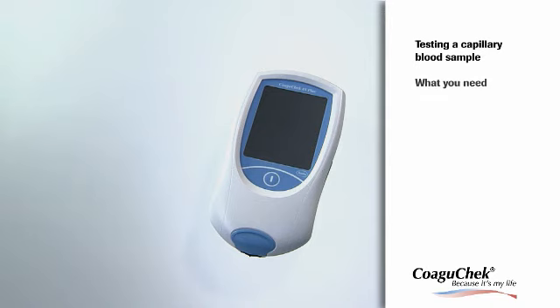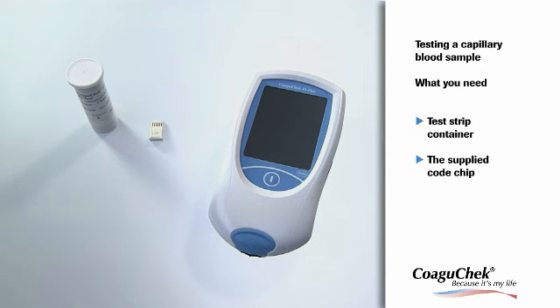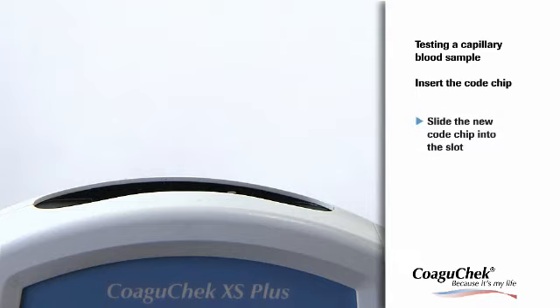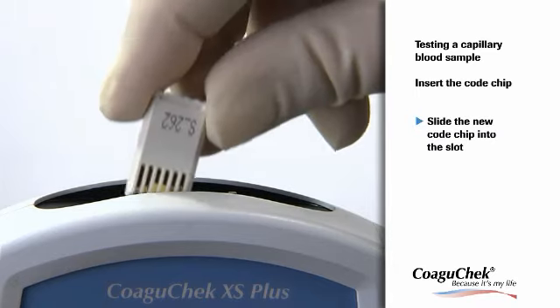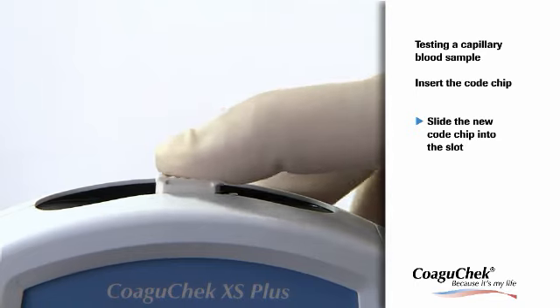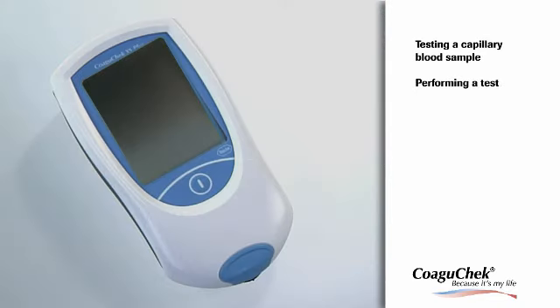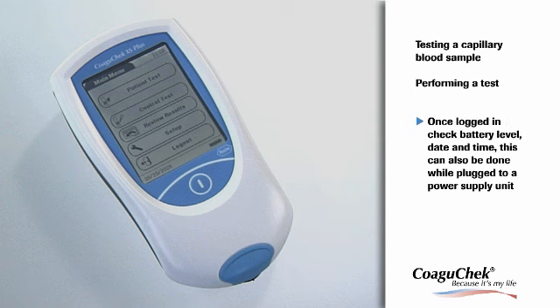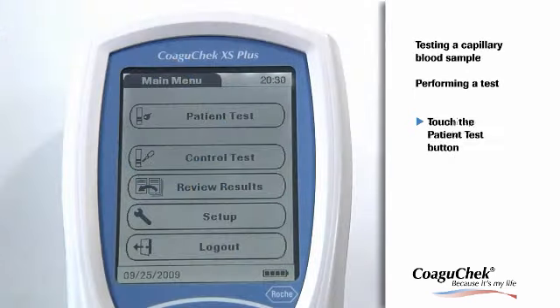Now let's see how to test a capillary blood sample. You need the test strip container with the supplied code chip and the lancing device — for example, the AccuCheck Safety Pro Plus lancets. First, slide the code chip into the slot on top of the meter until you feel it snap into place. Place the meter on a level, vibration-free surface or hold it in your hand so it is roughly horizontal. Turn the meter on by pressing the On-Off button. Wait until the main menu is displayed and then check the battery level, date and time.